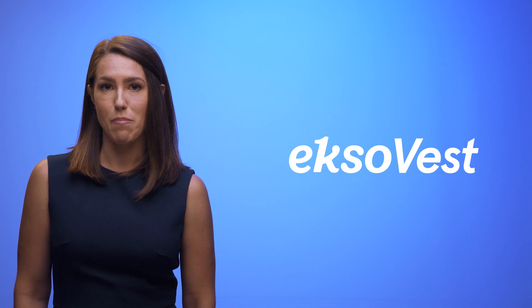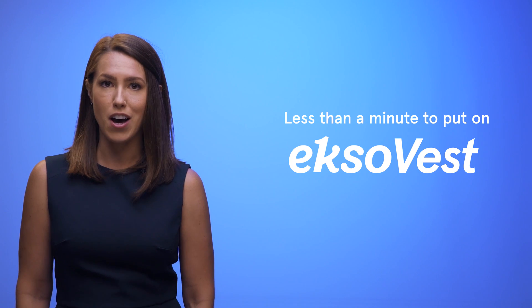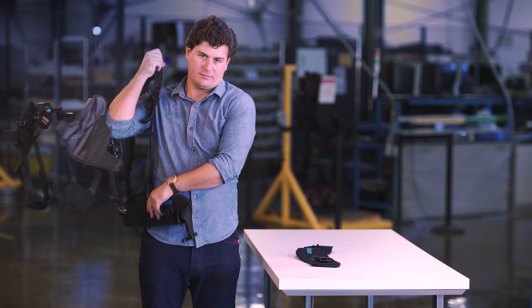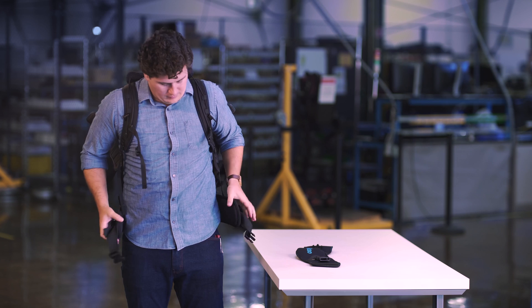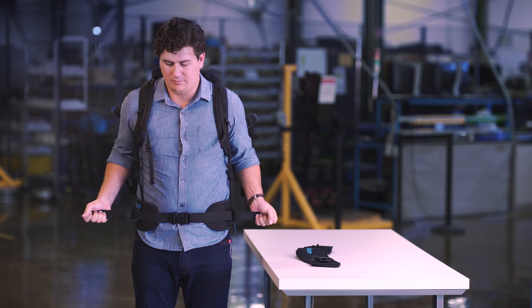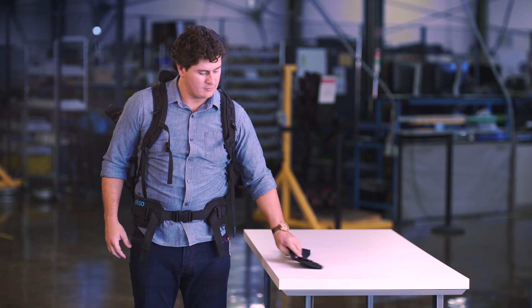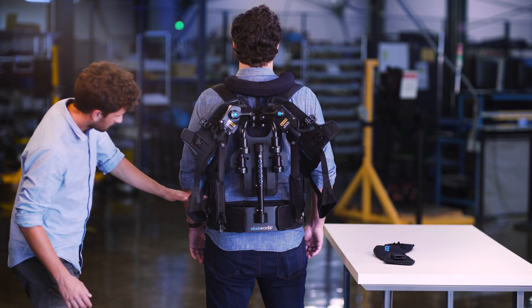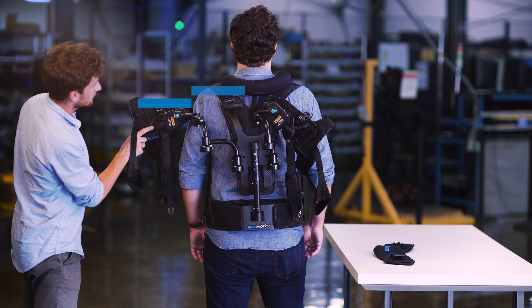Your ExoVest is like a backpack with a few more straps and a lot more power. It takes less than a minute to put on. Put your arms through the shoulder straps. Buckle the hip belt so it wraps around your pelvic bone and cinch it tight. Making sure the hip belt is tight will ensure your ExoVest stays in place throughout the day. If you need a longer hip belt, you can attach the extender. Once the hip belt is in the right position, the tops of the actuators should align with the top of your shoulders.